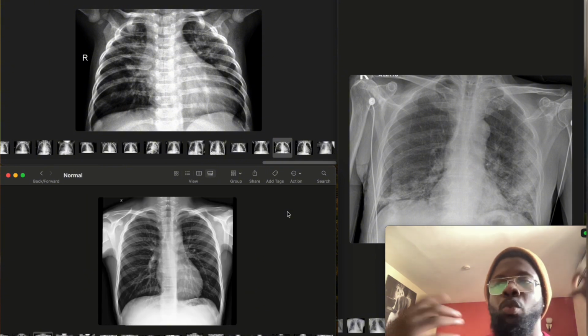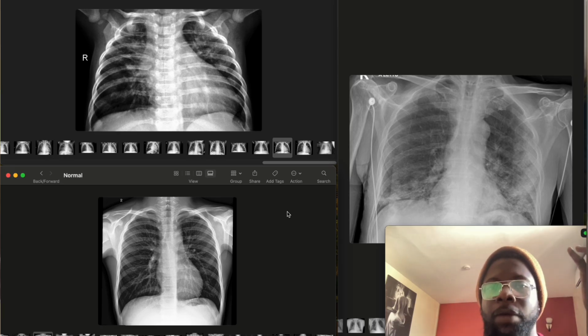So if a patient walks in right now and wants to know if they have COVID, they have to run an X-ray to see how the lungs look. And during COVID, they have a lot of patients, and it could be somewhat impossible for doctors to be efficient scanning and checking all those things. A model like this can come in and help that situation. So without taking much time, let's dive right into it.